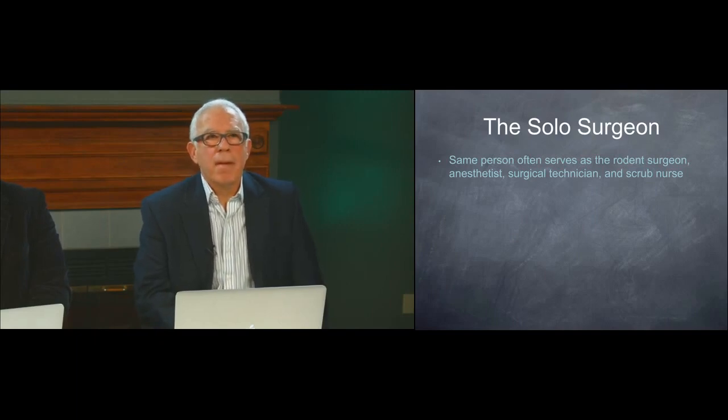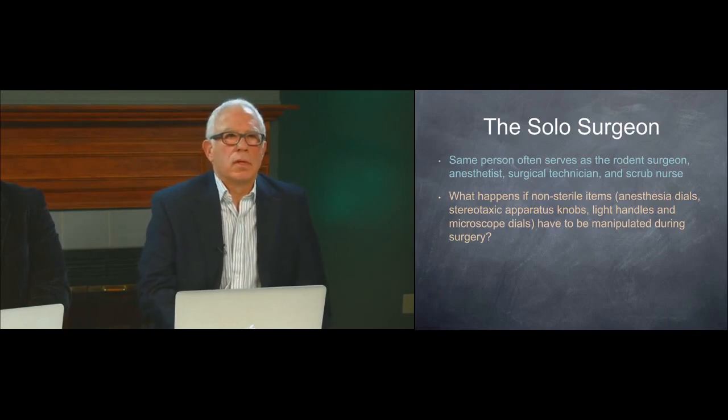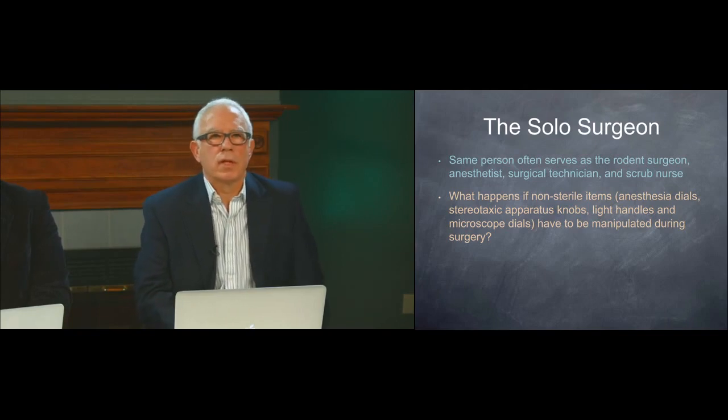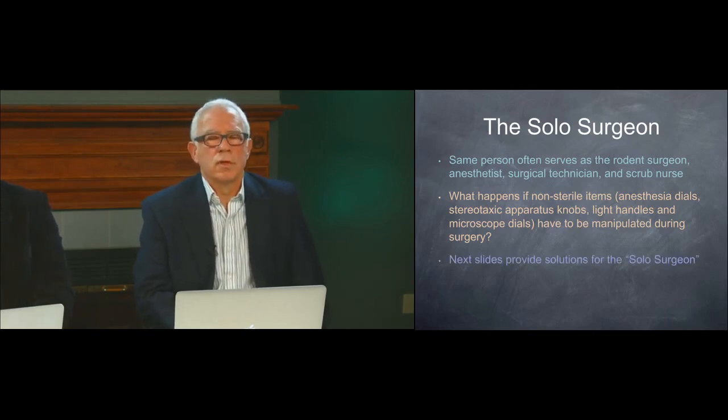So what happens if you are the solo surgeon and you have to manipulate the knobs of the stereotaxic apparatus or the anesthesia dials during surgery? Now you have to make those adjustments and you have sterile gloves. So the next slides provide solutions for the solo surgeon.